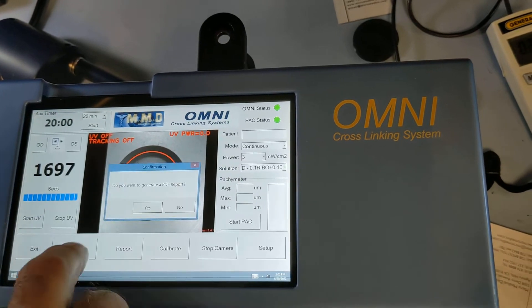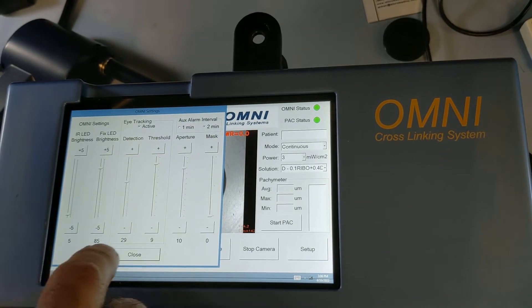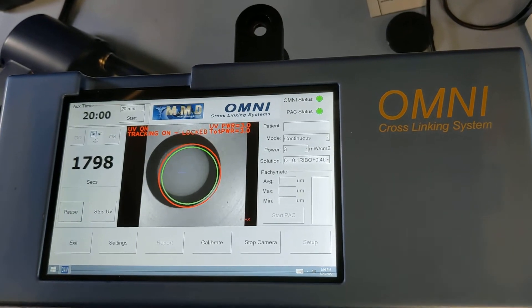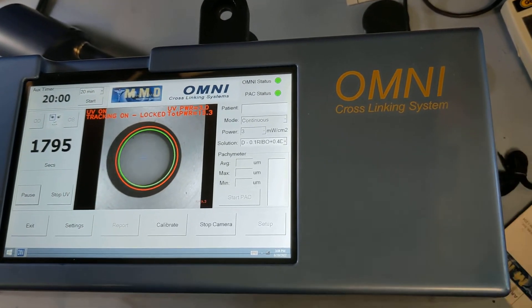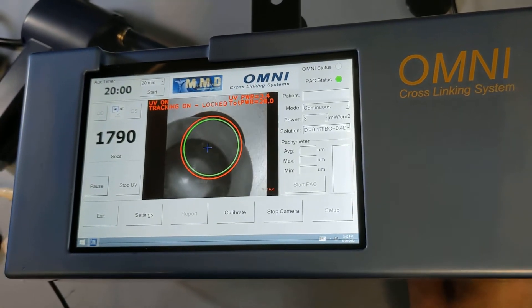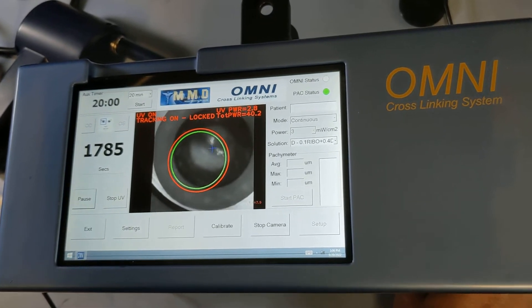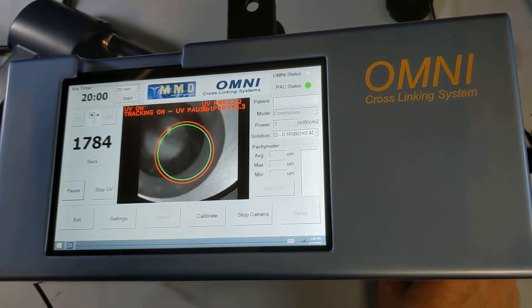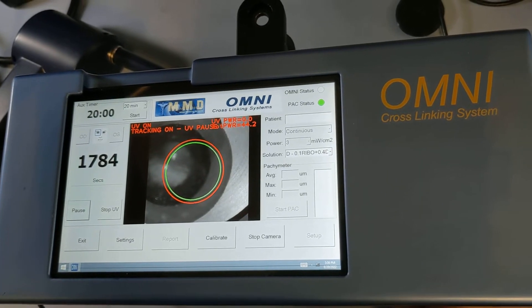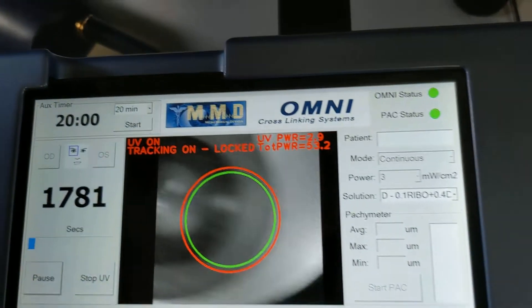For instance, I can show you: if I enable active tracking and lower the IR to the lowest setting at 5 and start the test — placing the eye in — you can see it's toggling between paused and locked, showing tracking instability at that low IR level.